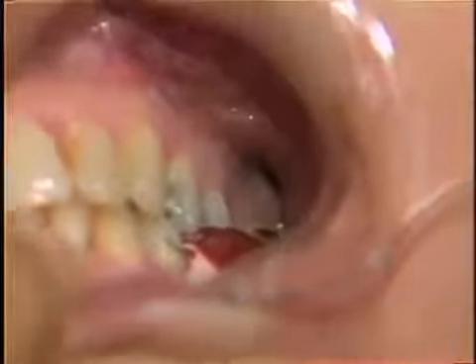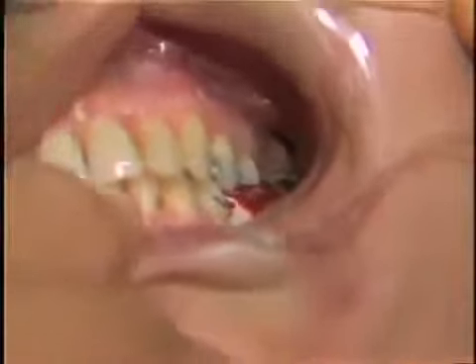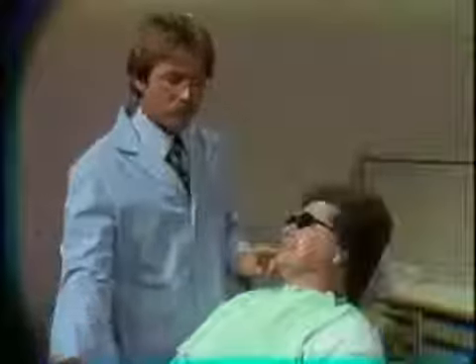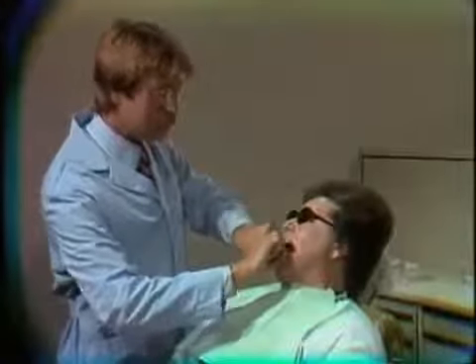Okay, now squeeze. Tilt your head down just a little bit. That's right. And the teeth have recorded now that area of centric between centric relation and centric occlusion. Just open and close a couple of times. Very good. Okay. Now, before we go any further with any excursions, we're going to examine the indentations that she's made.